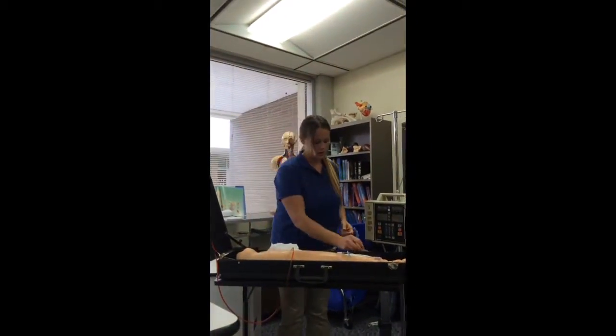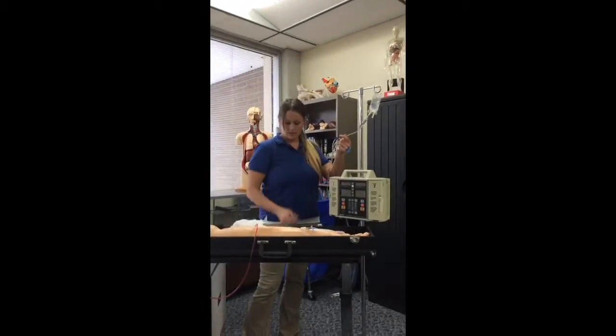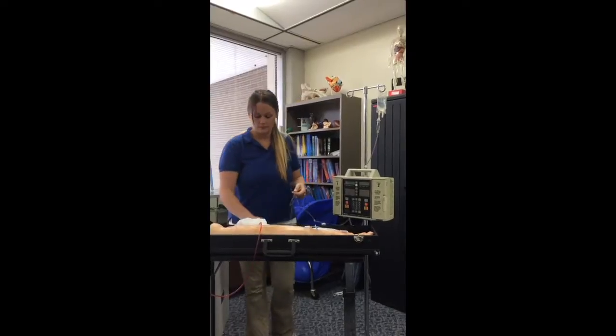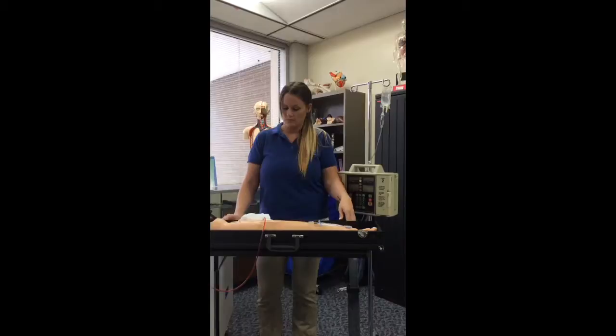Now I'm going to check the MAR, make sure my medication's correct, everything's correct. I need to label the tubing: the date, time, initials. Gather up my stuff. Then I'm going to enter the patient's room.